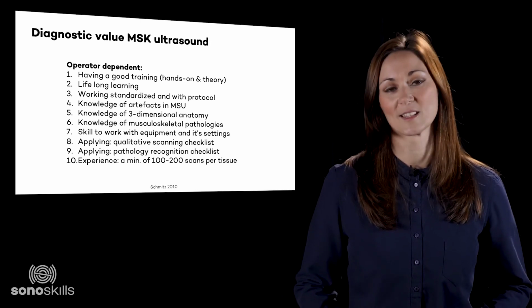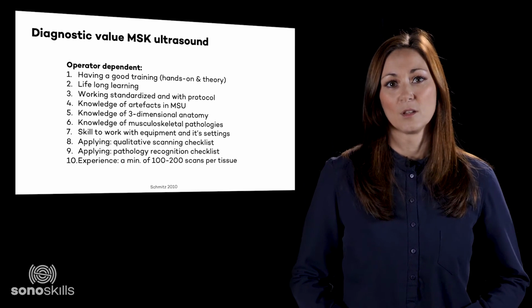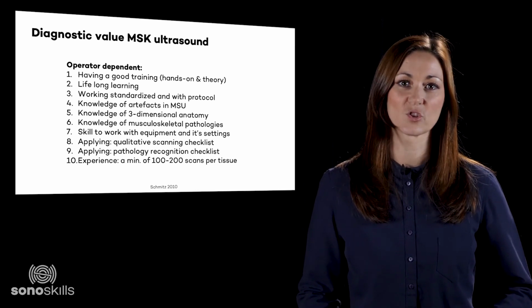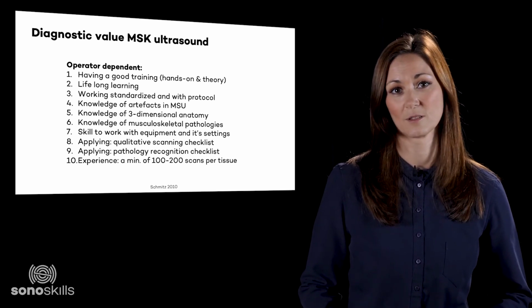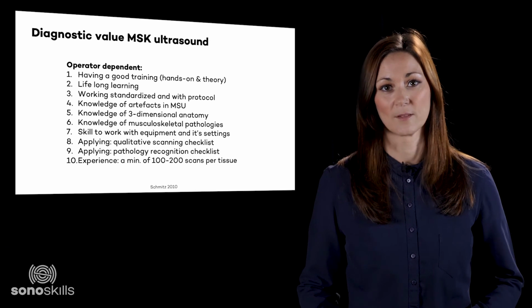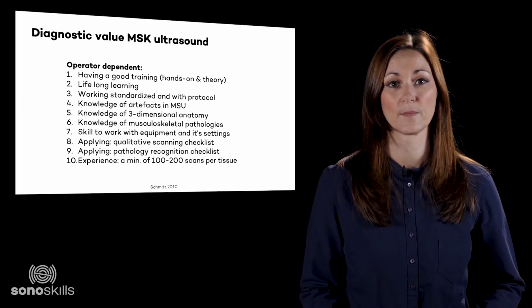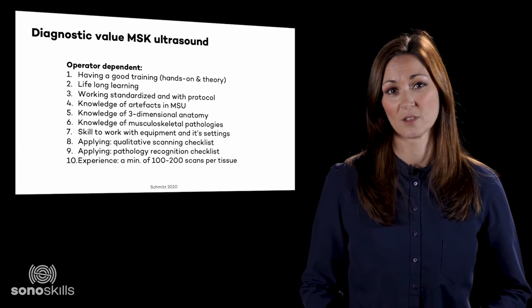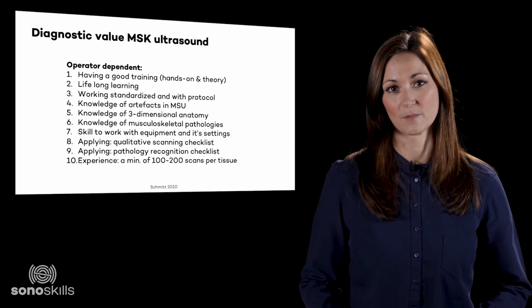Sonographers need to work in a standardised way and use existing protocols as a base to start scanning a certain joint. You will learn these protocols in the course. Using the protocols makes sure that you scan the absolute basics that is needed for a proper ultrasound assessment. In the next course levels, you will learn extra skills to become a more experienced sonographer. Knowing about artifacts is important. You will learn about these artifacts and their importance in another presentation.